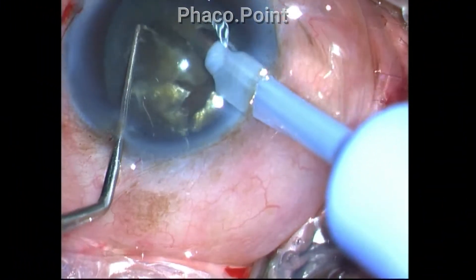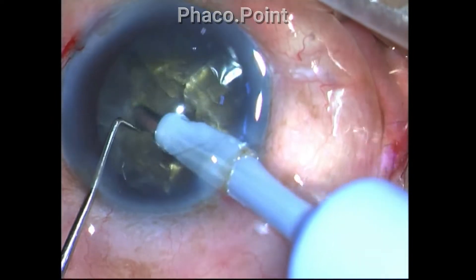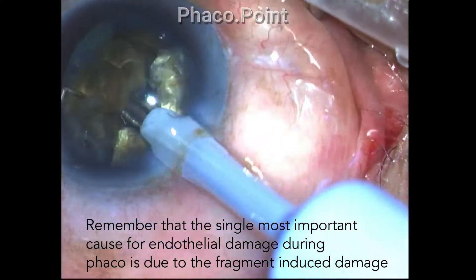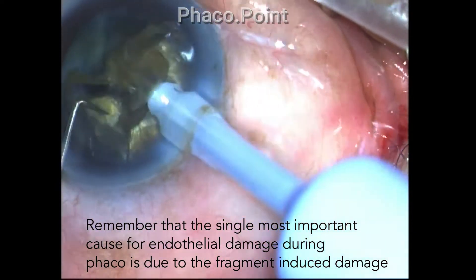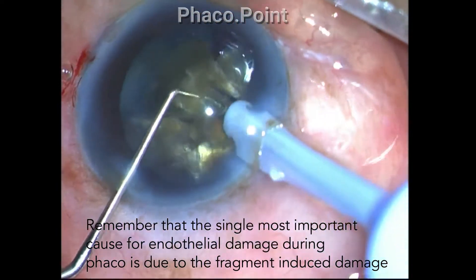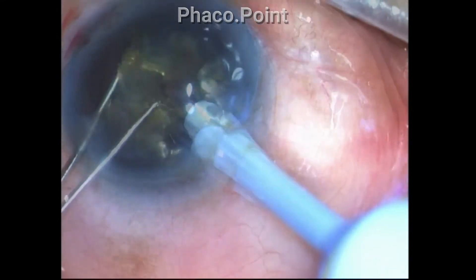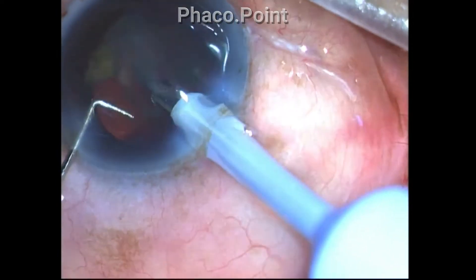Let's look at another case where I am performing fragment removal. This is also a grade 3 to 4 nuclear sclerotic cataract. As I mobilize and downsize the piece, I'm not paying attention to the small fragments circulating in the anterior chamber — I'm totally ignoring that small piece and attacking the next fragment without completely removing all the pieces released from the first nucleus fragment. The only thing we need to worry about is the mechanical damage induced by the fragments onto the endothelium.